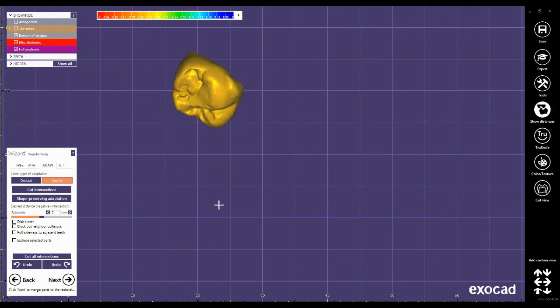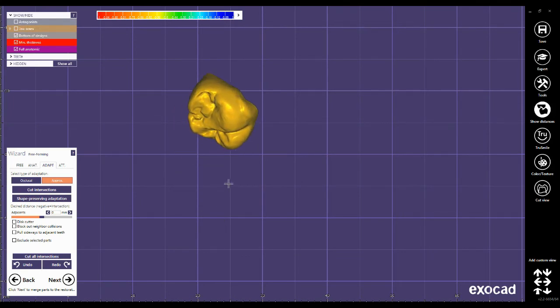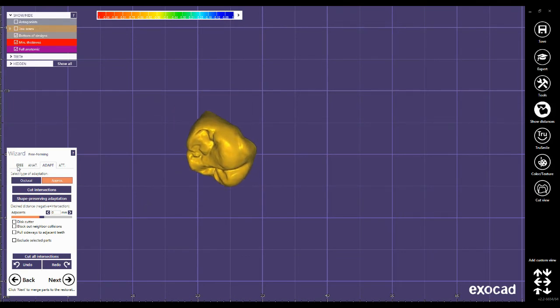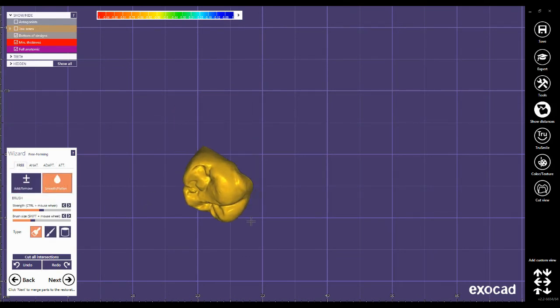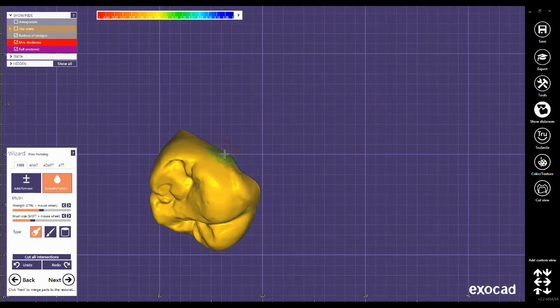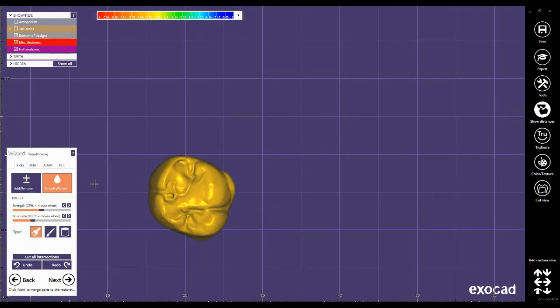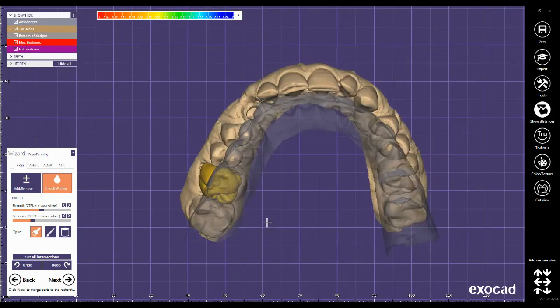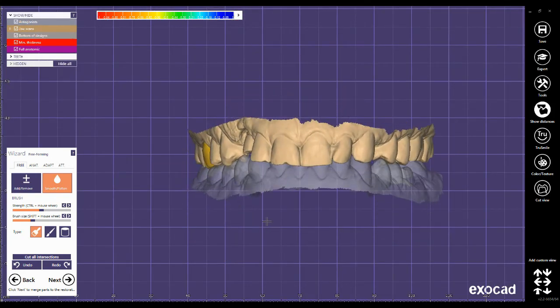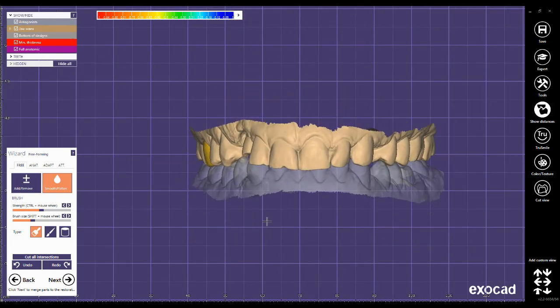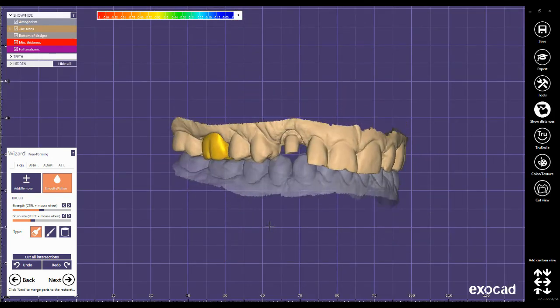Final check, not to miss anything. Check also with the antagonist. Everything looks good.